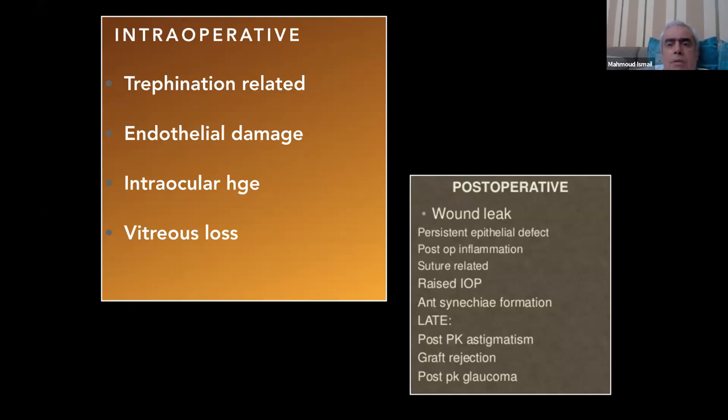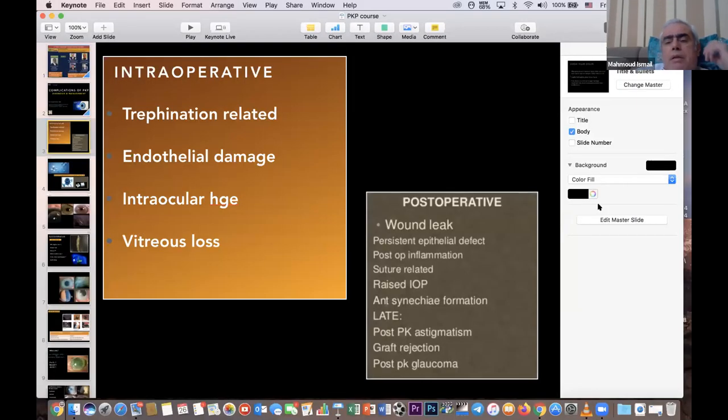Once you have pressed on the cornea, the K reading has changed to a more physiological keratometry, so the real center of the cornea will appear. Another tiny trick, you make four dot centration by marking 7 millimeters from the limbus at the four cardinal hours, and then you apply in the center. Actually, if you are doing a normal K reading, you won't have a big problem.